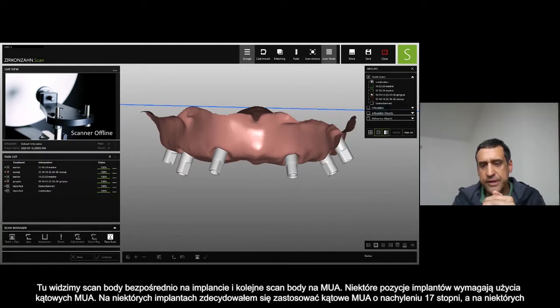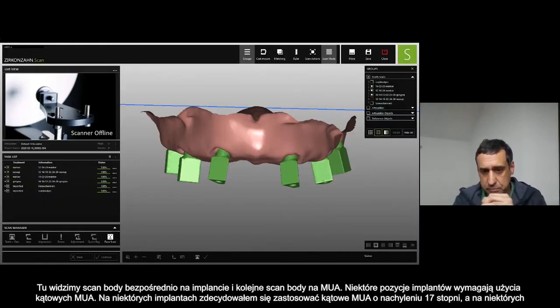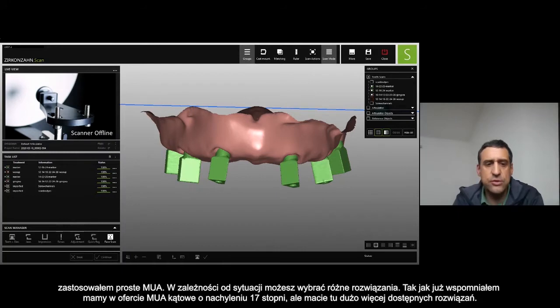Here you can see that these scan bodies are directly on the implants and the other scan bodies are on the MUA — on the multi-unit abutment. In some of these implant positions I was using the angulated MUA — 17 degree — and in others I used the straight one. It depends on the case and the situation.